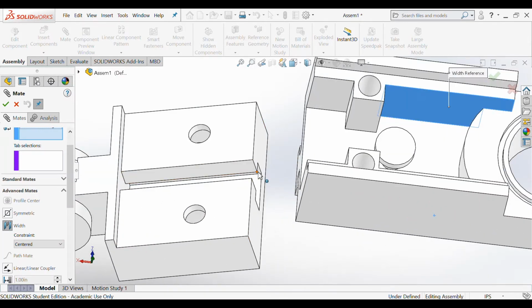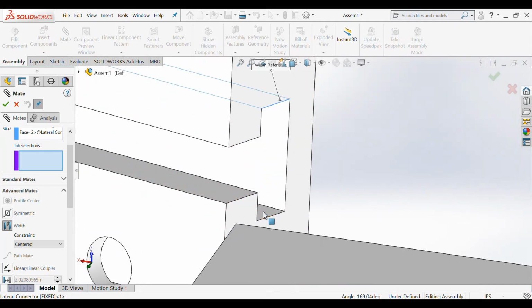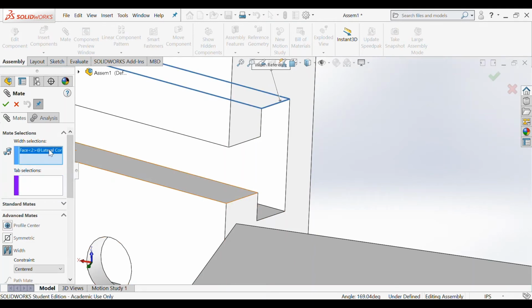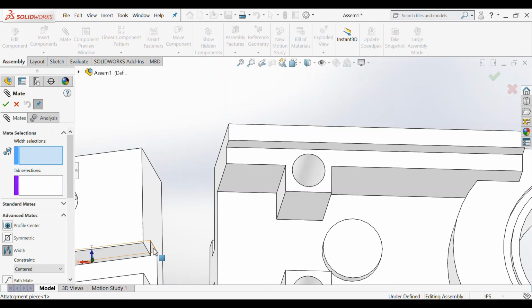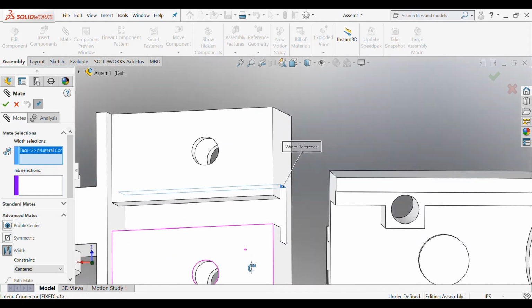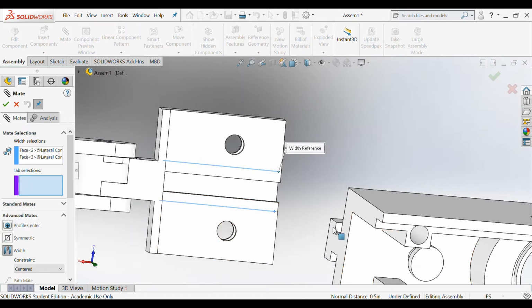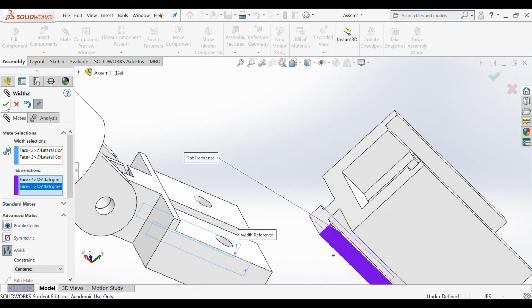We're going to zoom in and click this inner surface and this one. Zoom in a little bit more. So I'm going to go ahead and delete these so we could start over. I'm going to click the interface, and that interface, and then with tab selection we're going to click the outer face of this attachment piece and the outer face. Click that check mark.